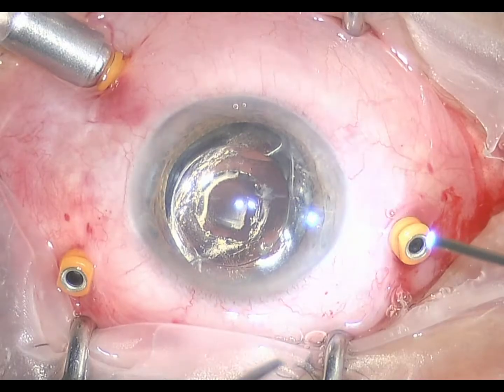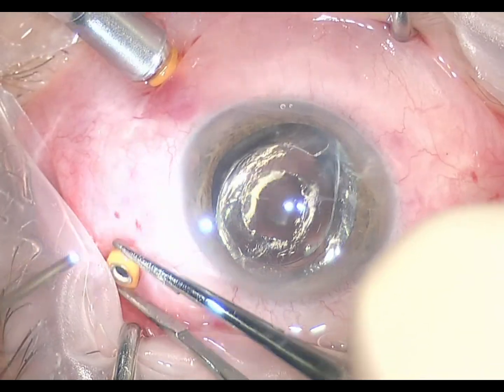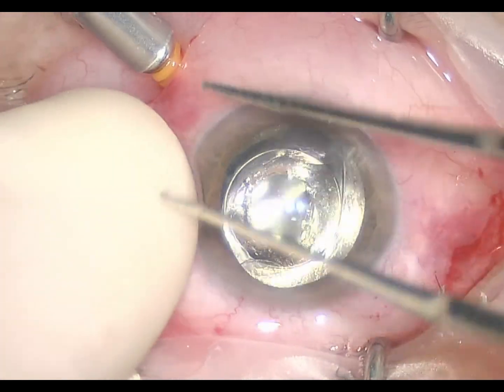Here you're seeing gas put into the eye. Once the macular hole has been relaxed by peeling the internal limiting membrane, the eye is filled with a long-acting gas. Finally, the trocars are removed from the globe, and these incisions are small and they self-seal. Their integrity will be checked at the end of the surgery, and then finally antibiotics are injected.